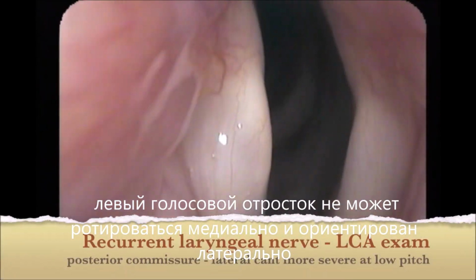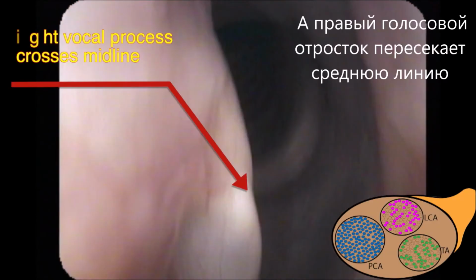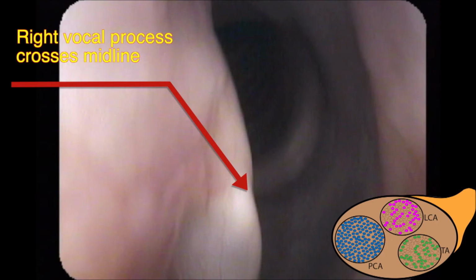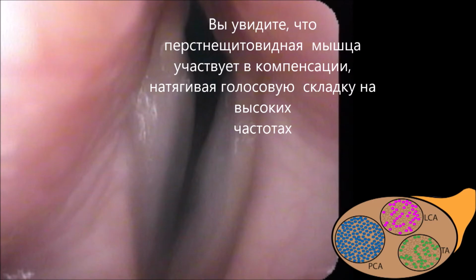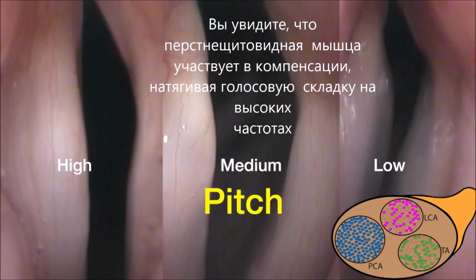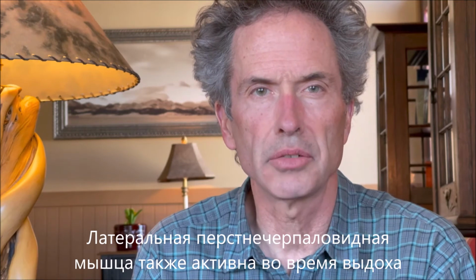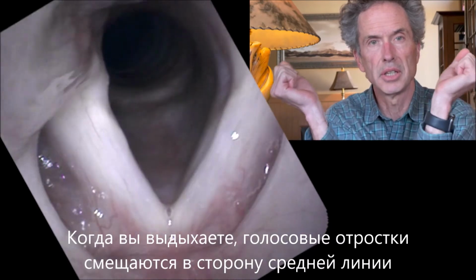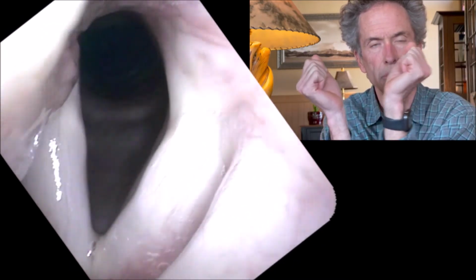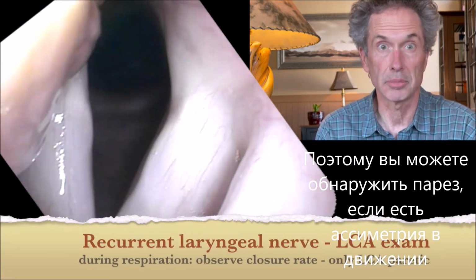The left vocal process cannot rotate medially, it's canted laterally, and the right vocal process actually is crossing the midline. If you view the posterior commissure at low, medium, and high pitch, you'll see that the cricothyroid muscle helps it to compensate by pulling the left vocal cord straighter. So at low pitch, the left vocal process is severely lateral. The LCA muscle is also active during the expiratory phase of respiration, so that when you are breathing out, the vocal processes should come towards the midline. So if there's an asymmetry in the range of motion, you can detect a weakness.